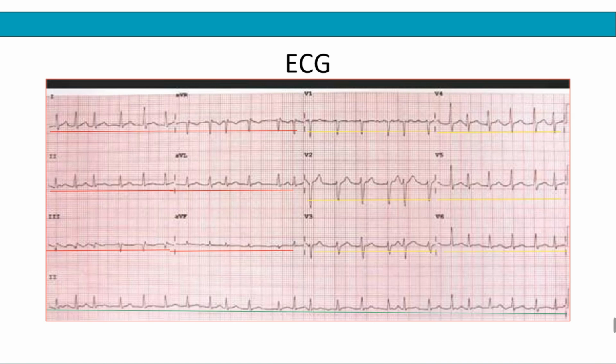So first you need to determine the rate. But before you determine the rate, you need to determine the rhythm, because the rhythm of the heart dictates how you determine the rate of the heart.